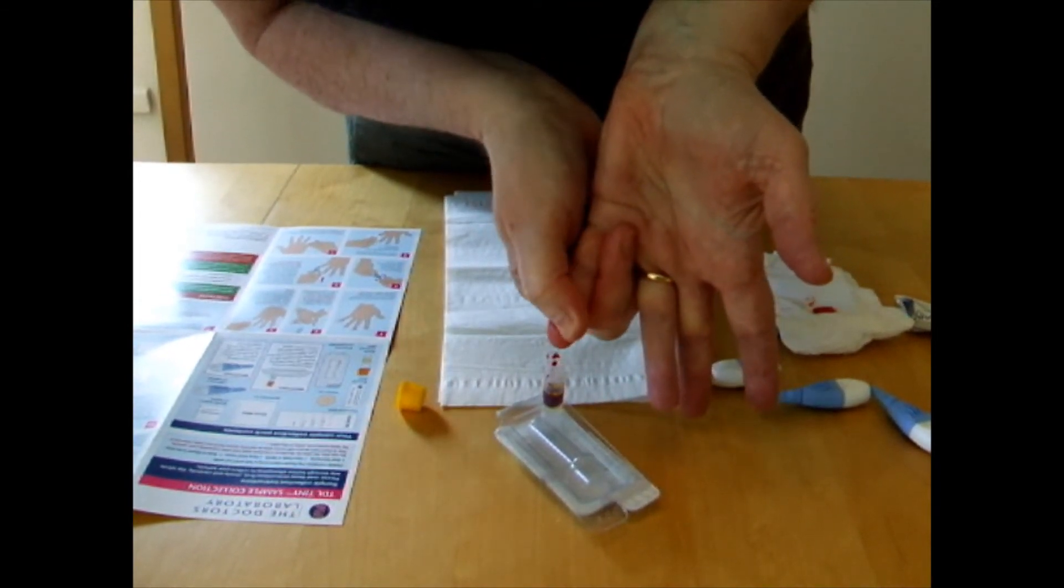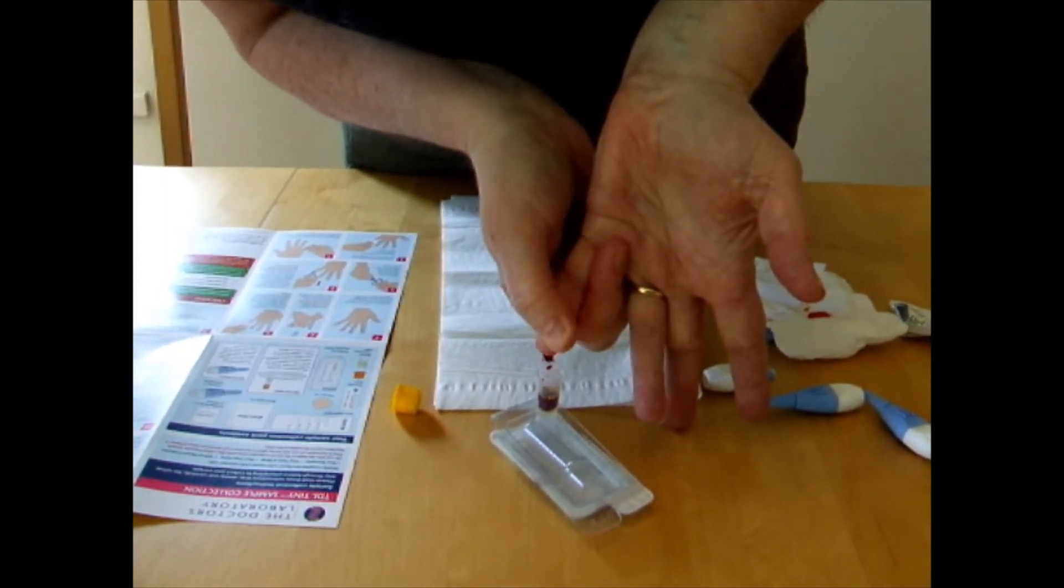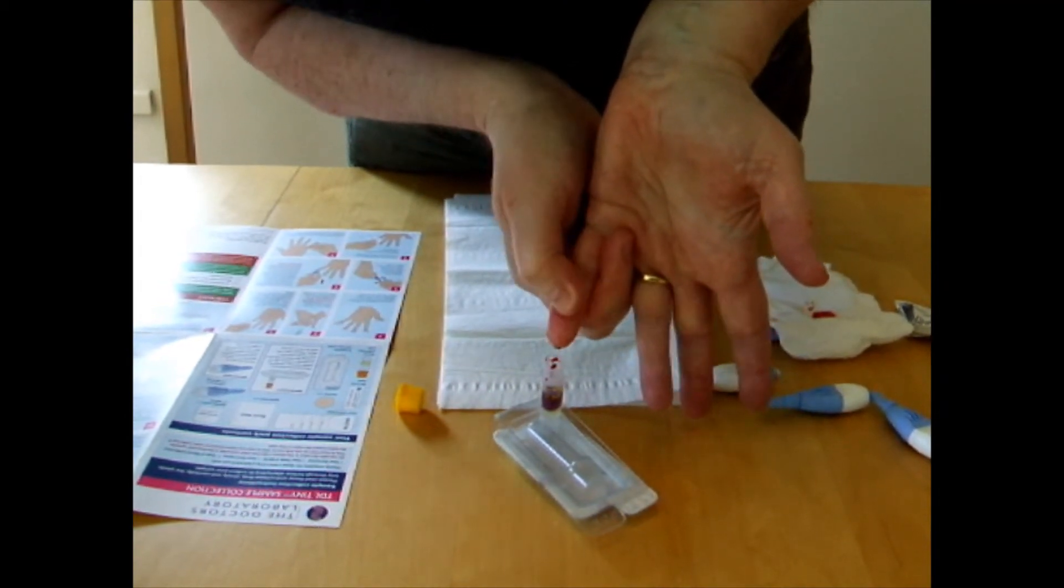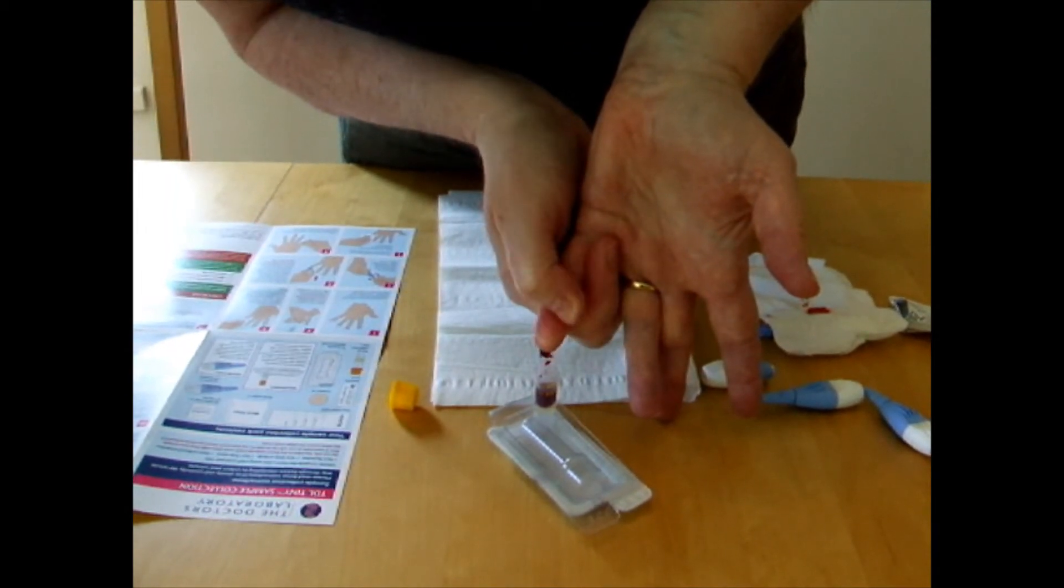If you find that you can't get enough blood out of one finger, repeat using another finger.